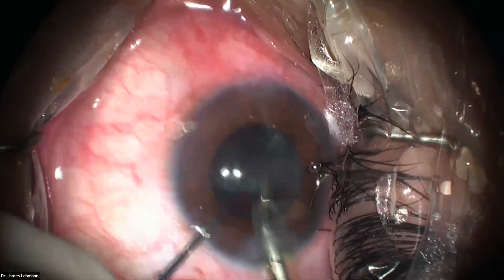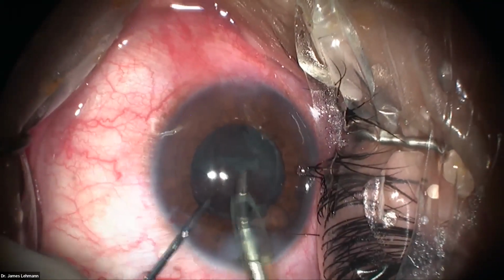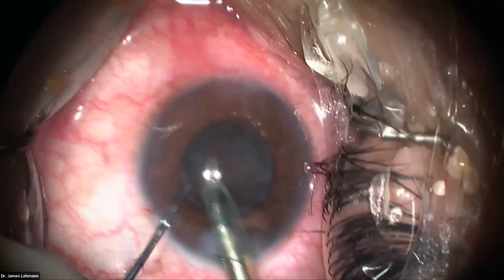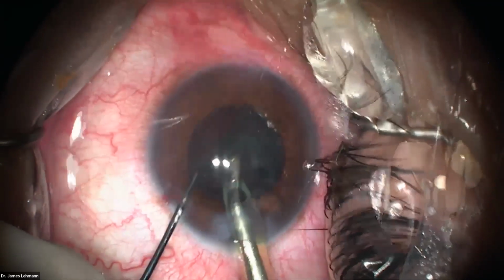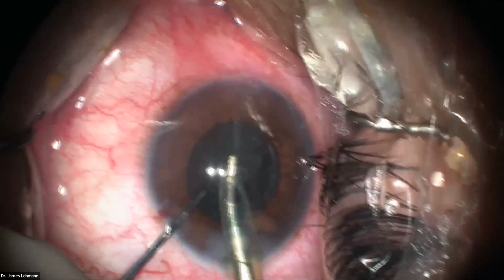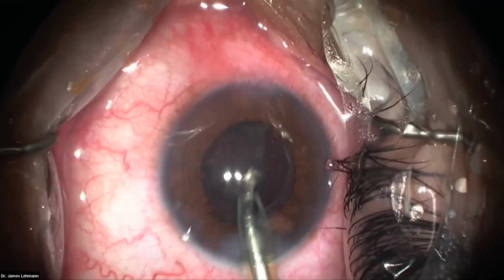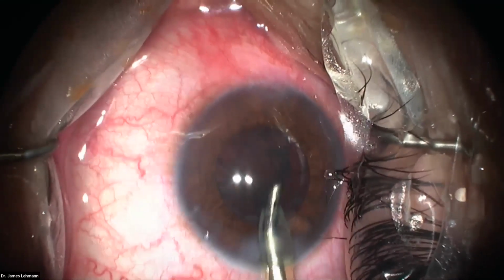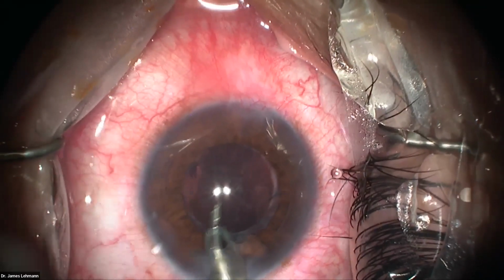So it's connected to that other little piece. So they'll both come up together here shortly. Okay. I'm going to get close to the iris here, so I have to be careful. I'm not going to eat it. I'm just going to pull the rest of it up here to the middle. And then I'm not really moving my phaco tip. It's just nice eating all that. I'm going to remove my second instrument. Rock solid chamber. Everything's good. Okay, so we're fine.